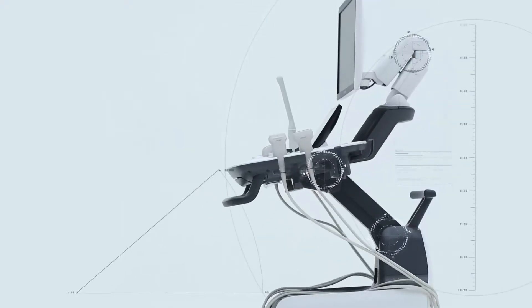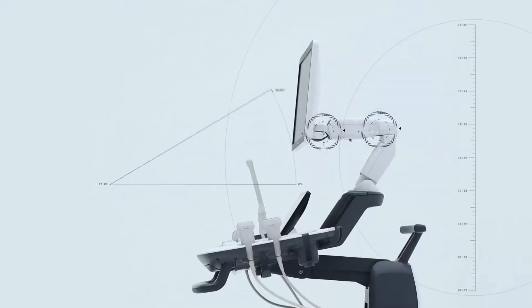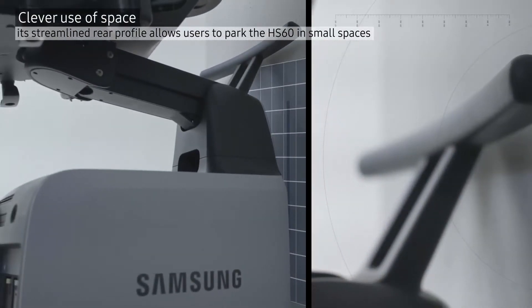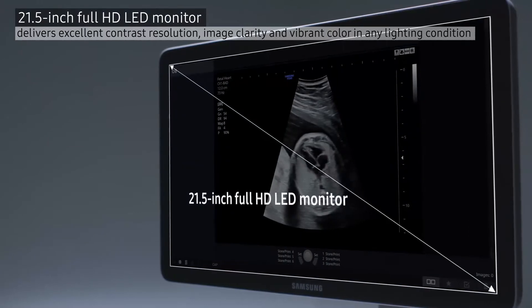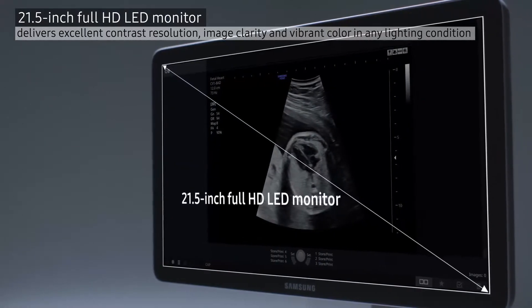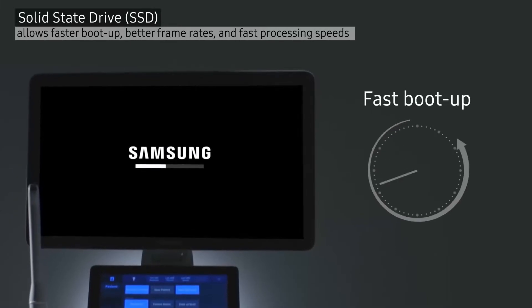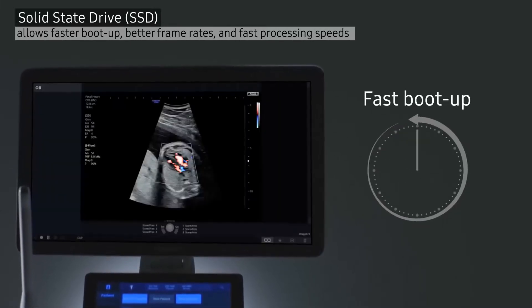HS60's compact size with streamlined rear profile fits in small spaces. A 21.5-inch LED monitor provides excellent contrast resolution, and Samsung's advanced SSD delivers fast processing speeds for outstanding performance and convenience.